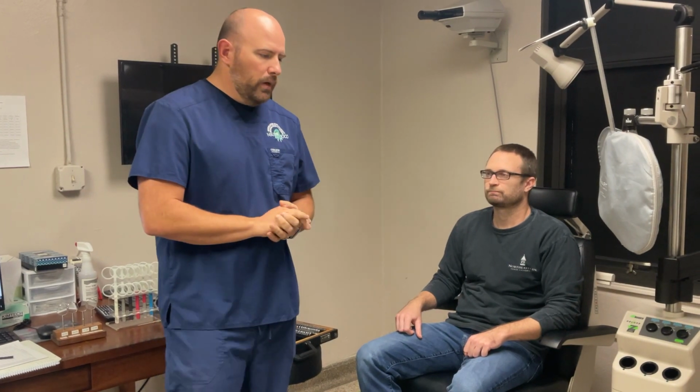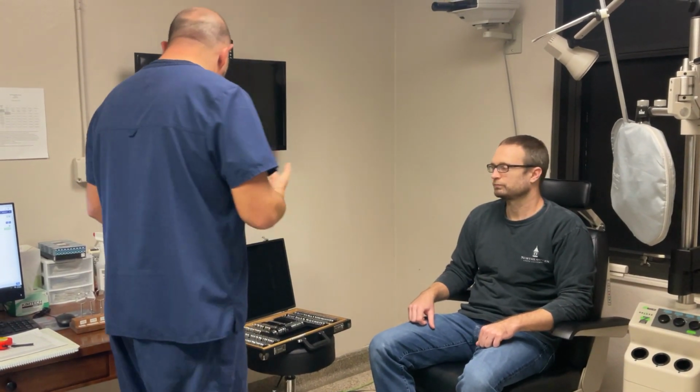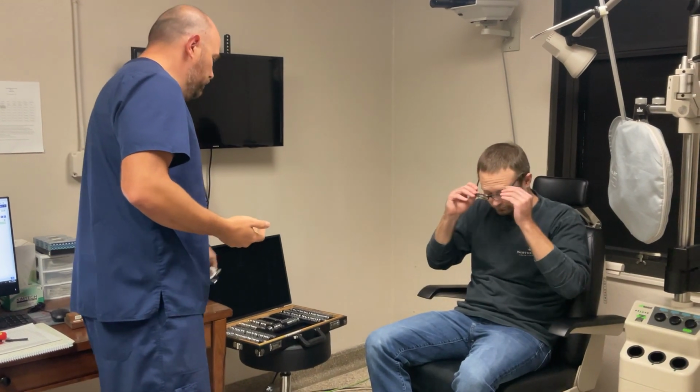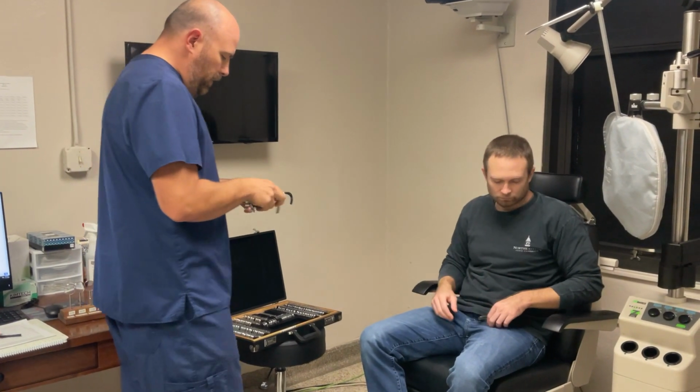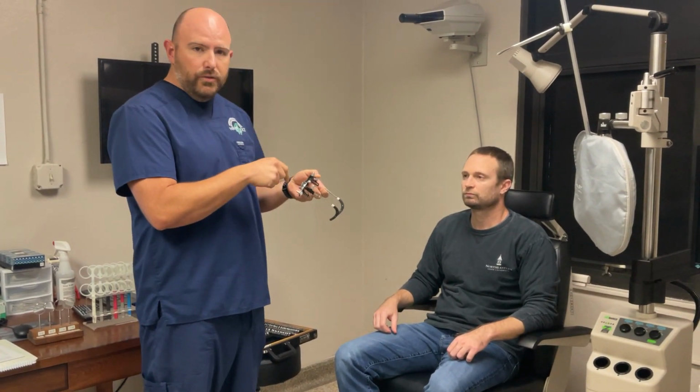All right, so we're just going to imagine that we've already got visual acuities and retinoscopy findings, and so we're going to start by putting on the trial frame. I'll go ahead and have you take your glasses off for me, if you could please. We already had the retinoscopy findings, and just like in the proficiency, those are given to us, and I have placed them in the trial frame.